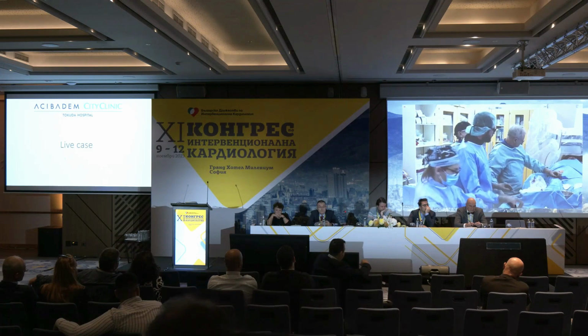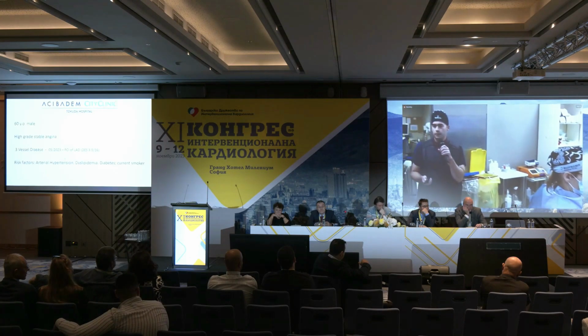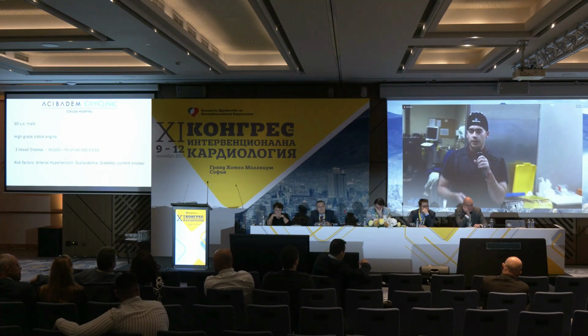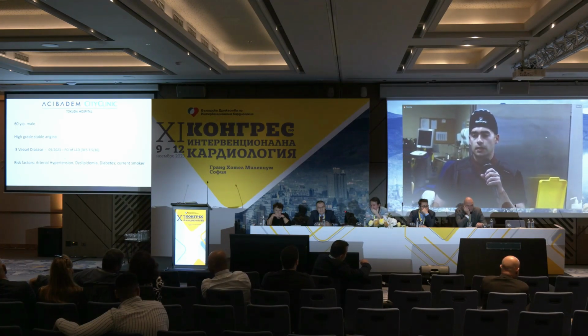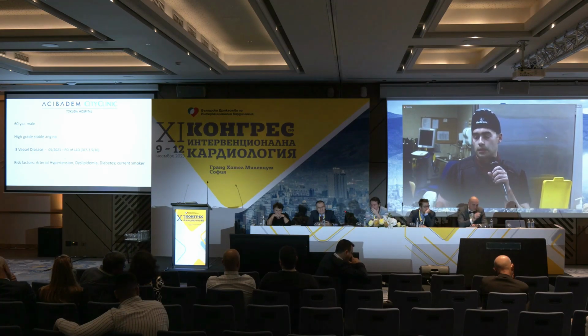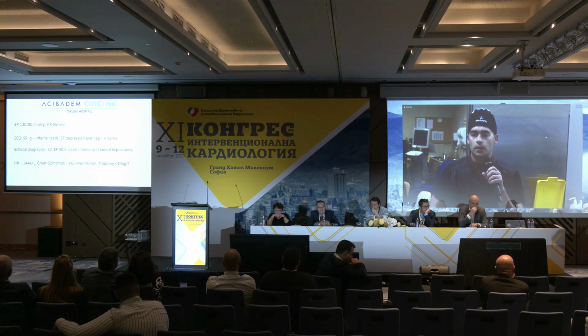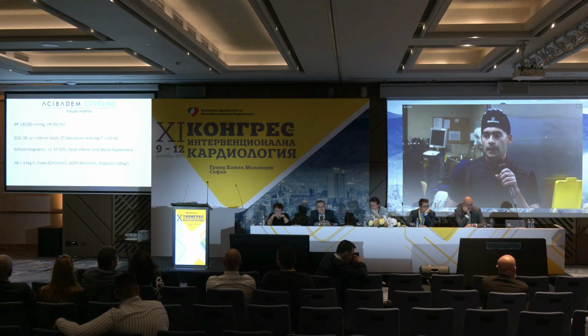Okay. Hello, everyone. Let me present the third case from our center. It's about a 60-year-old male patient with high-grade stable angina. The patient has three-vessel disease, and this year PCI of the LAD was performed with implantation of one drug-eluting stent. The patient has typical risk factors for cardiovascular disease. You can see optimal blood pressure and heart rate. From the ECG, we have sinus rhythm with Q waves in inferior leads and ST-T changes in V3 to V6.